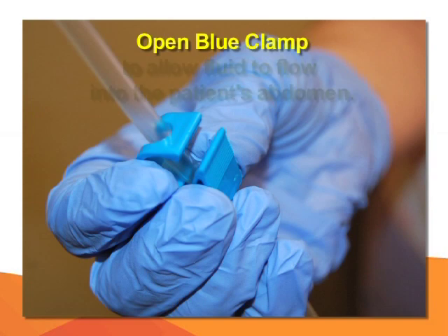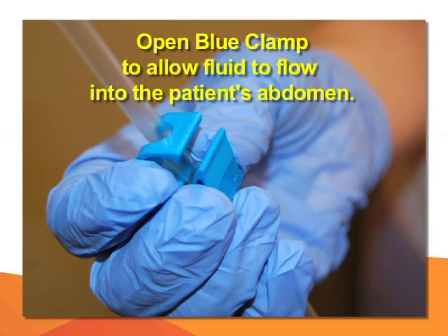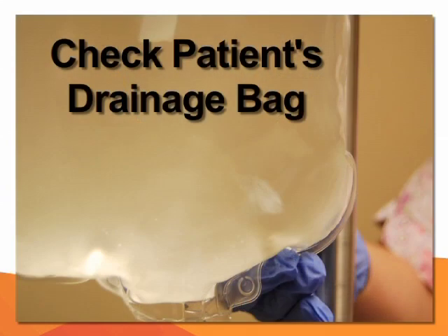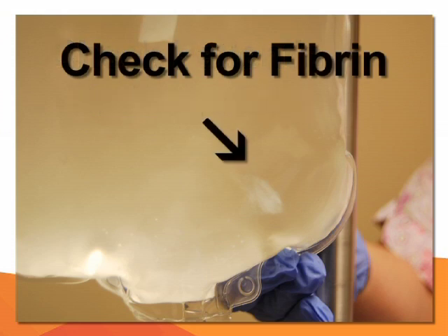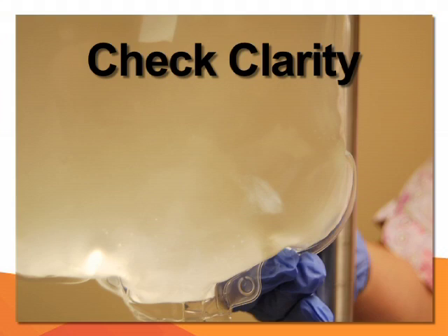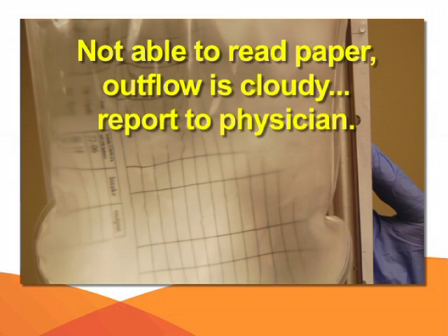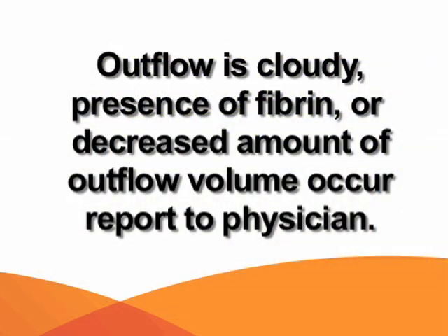Open the blue clamp from the dialysate bag to let the fluid flow into the patient's abdomen. While the dialysate solution is infusing, check the fluid in the drainage bag for fibrin, which looks like cotton wool floating in the fluid. Check for clarity of the fluid — a quick way is to place a piece of paper with writing underneath the drainage bag. If you are able to read the paper, the outflow fluid is clear. If unable to read the paper, the fluid is cloudy, which needs to be reported to the physician. If the outflow fluid is cloudy, fibrin is present, or a decreased amount of outflow volume occurs, notify the physician.